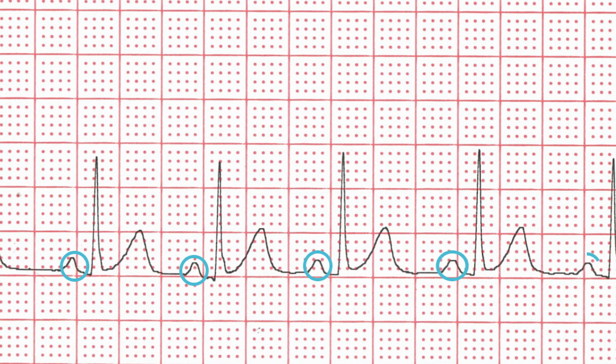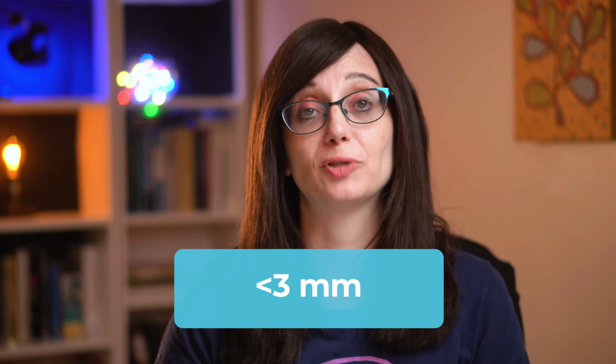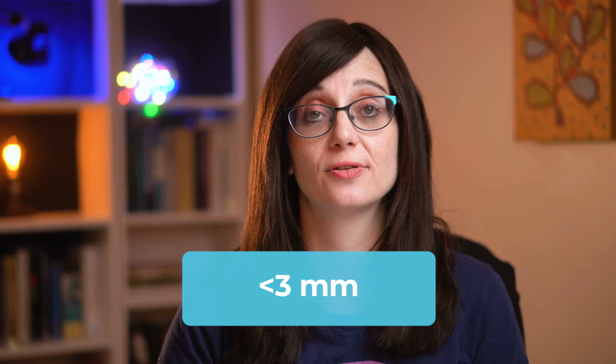We need to make sure there is a P wave before every QRS complex, and we need to check that there is a normal PR interval. The PR interval is a short lag as the electrical activity reaches the atrioventricular node. The P wave amplitude should be less than 3 millimeters. In less than 2-year-olds, the PR interval is going to be 0.08 to 0.16. In 2 to 15-year-olds, it's going to be 0.08 to 0.2. And in over 15-year-olds, it's going to be 0.12 to 0.2.